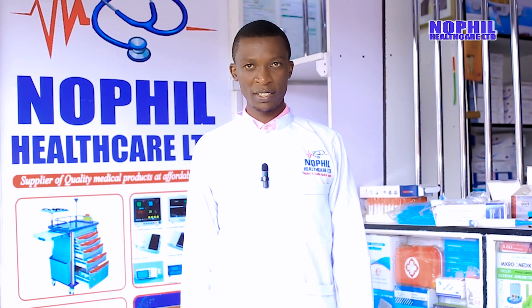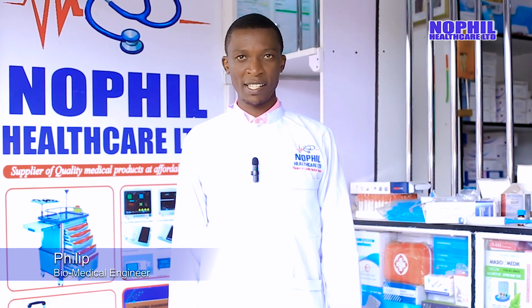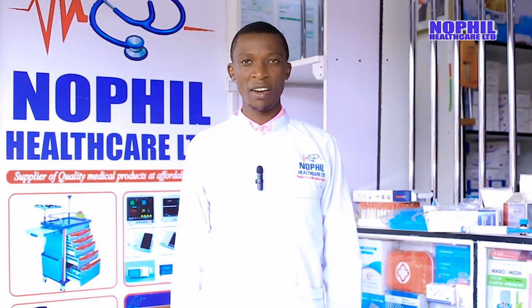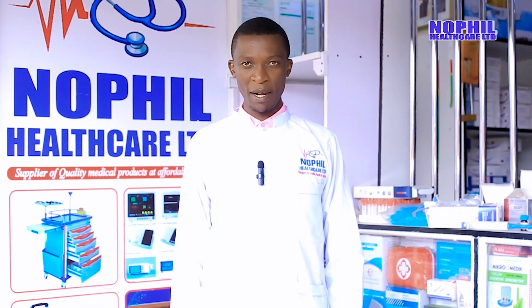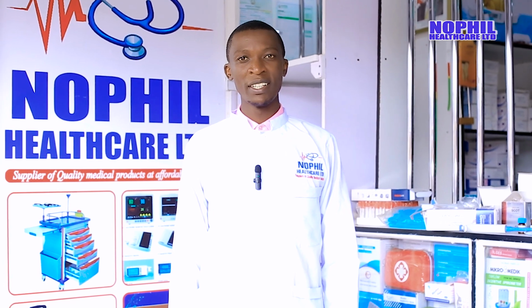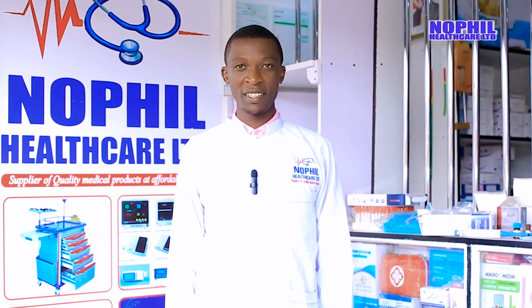In today's presentation, we are going to take you through our semi-automated biochemistry analyzer that we have in stock. Basically, it is a machine that is used in the medical laboratory to calculate the concentration of various particles and substances that are in the blood serum, as well as urine, as well as in the blood plasma. Basically, the machine uses the photometric principle to calculate and find out the functionality of the kidney, liver, as well as the lipid profile within the body.